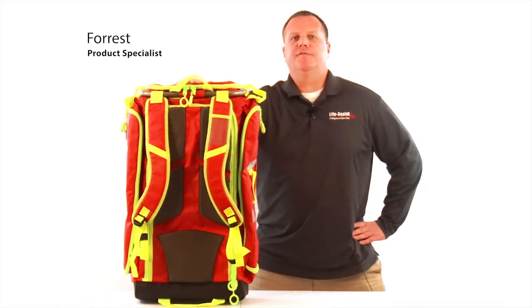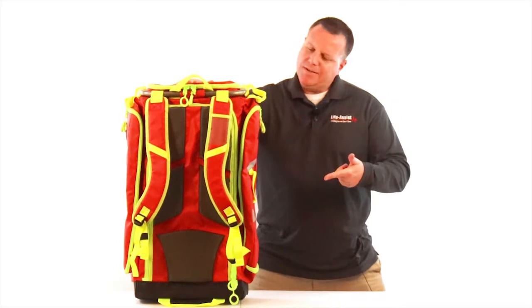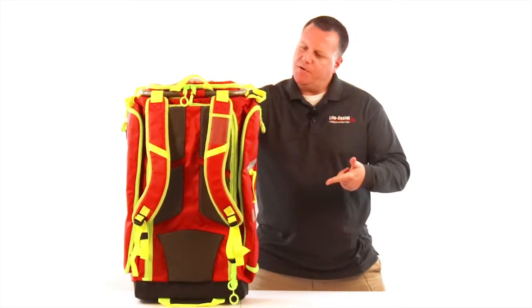Hey there, Forrest back with you at Life Assist Product Specialist. Today's topic: a deeper look inside the StatPax G3 Responder.